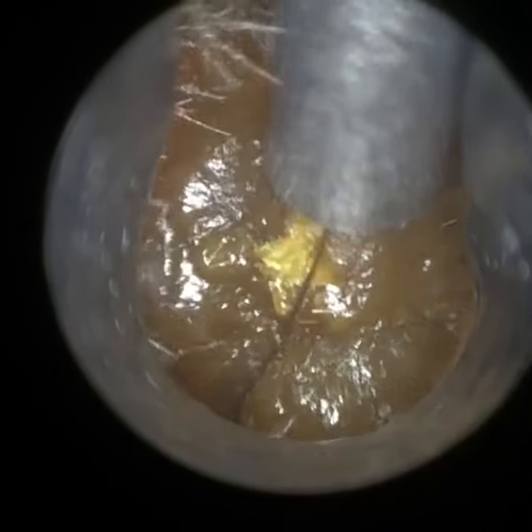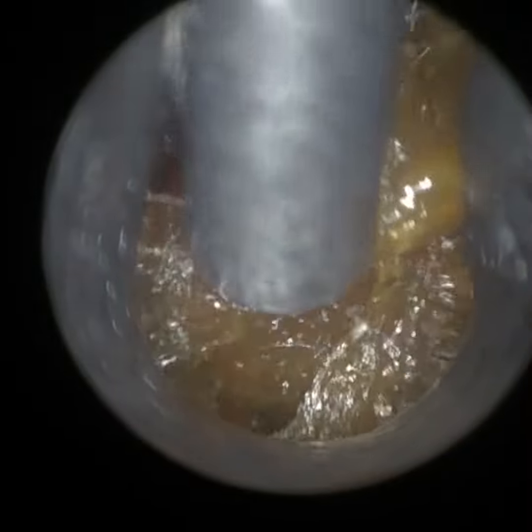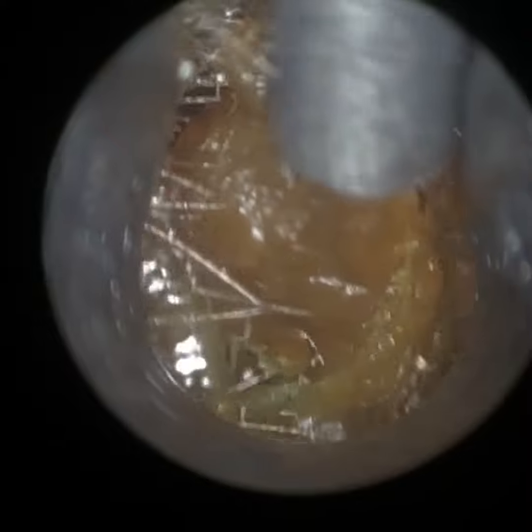The initial examination video was taken with our other device, the iClearscope, which is an endoscope. We are still manufacturing and training on the iClearscope, but we've stopped any training until the launch of the Waxscope, so it gives the people attending our courses the choice of both devices, and people might have a preference of one over the other, or even both.